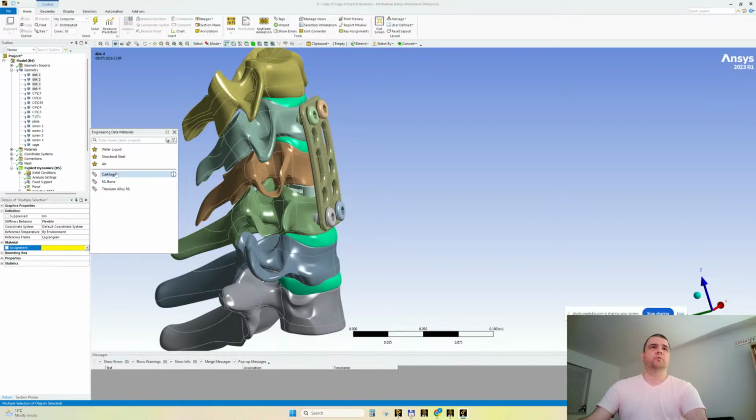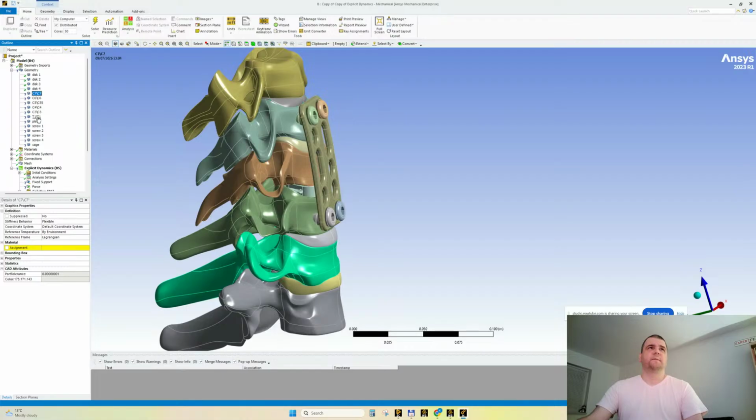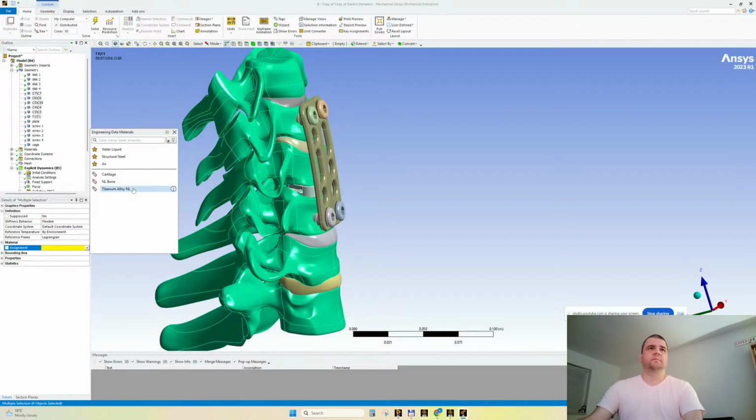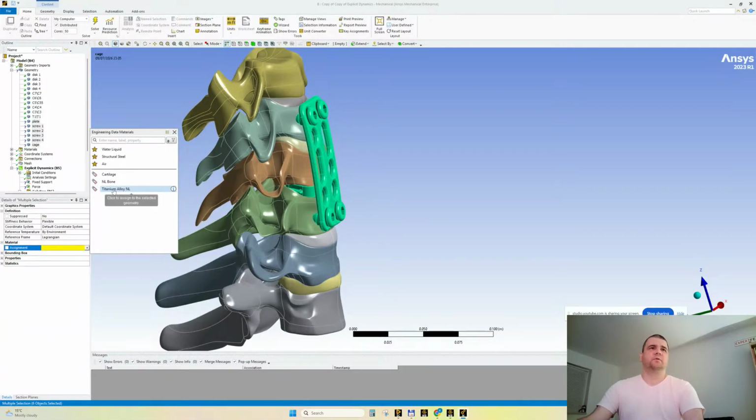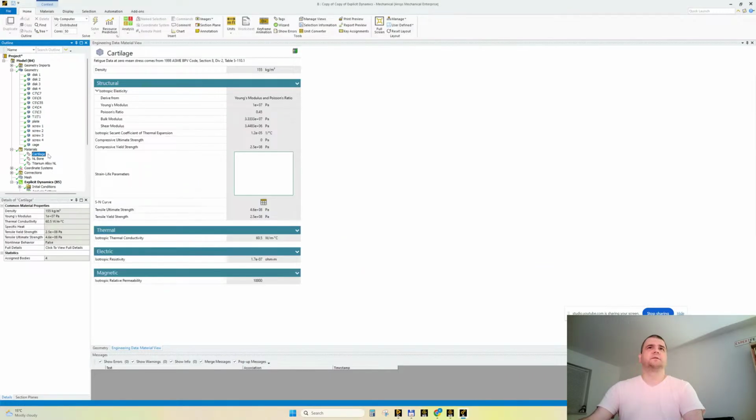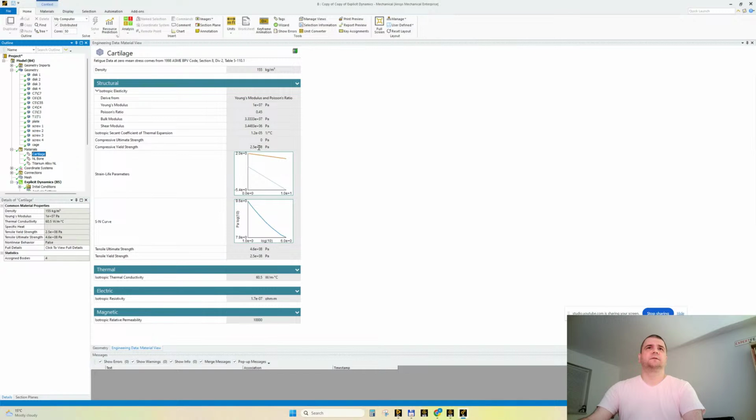Discs are made with cartilage. I will show the material properties in a few seconds, but they are also available on live stream 12. The bone vertebrae are made of nonlinear bone. The plate and the screws, then the cage, everything, let's make them of titanium alloy nonlinear. This is default, I will not insist on it. Only regarding the materials, these are some properties. Feel free to pause and see them. Did I change? Let's change the unit to have megapascals, yes. So 10 megapascals, yes.